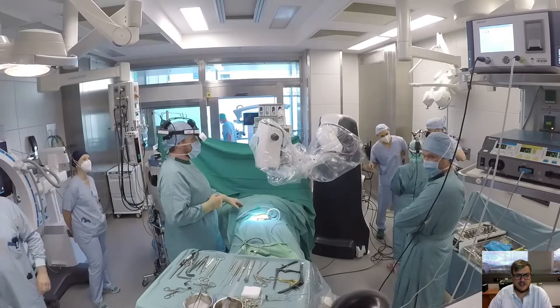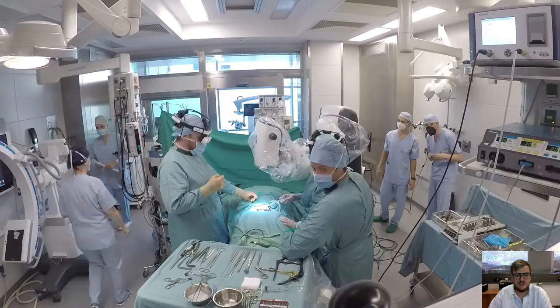The first is a lumbar decompression sequestrectomy. For me, this was the first robotic scope surgery here in Innsbruck. You can see in this fast-forward video that there were a lot of people interested in the new technology and how it works.